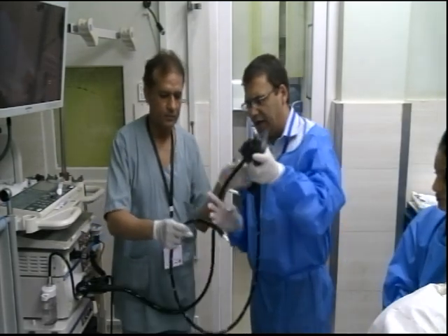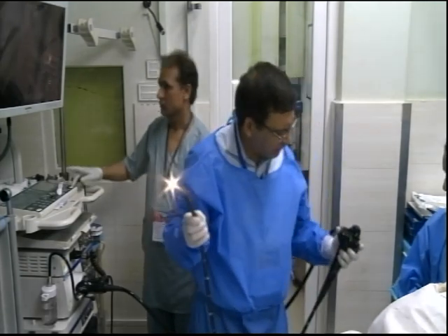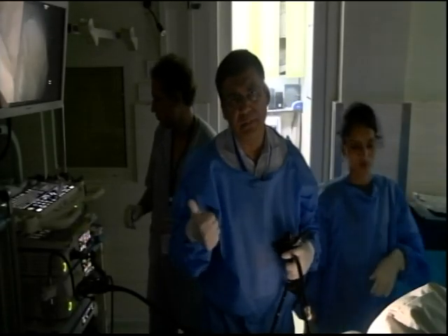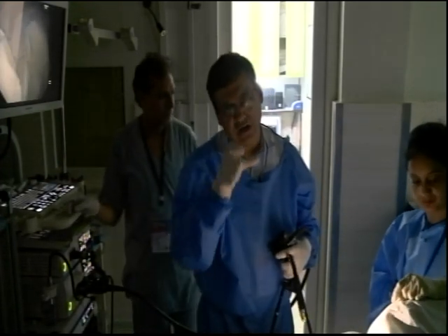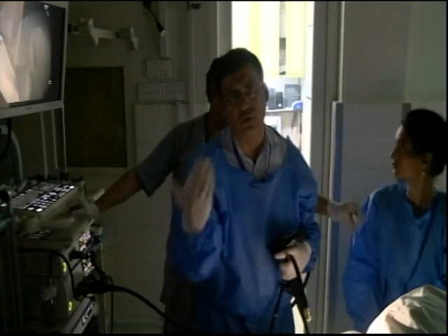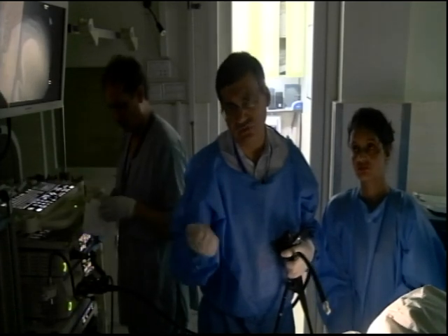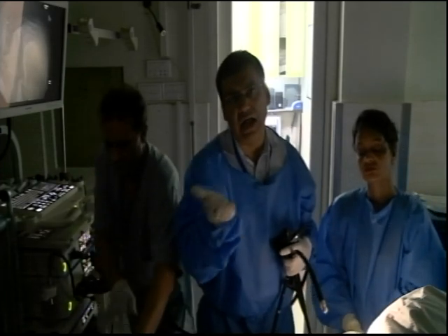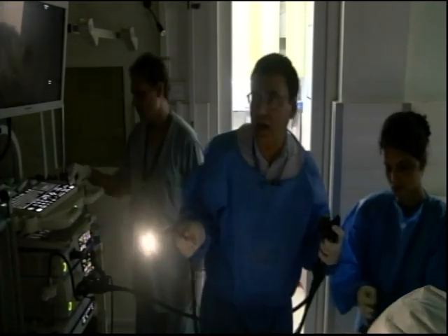So we'll go ahead and start with this. There's obviously a difference between male and female rectal EUS. When you do the male one, besides looking at the iliac arteries, the main thing is to look at the bladder, the prostate, and the seminal vesicles, which help you orient. In the female, after the vessels, we try to find the bladder itself and put that on the top. That gives you a landmark that that's the anterior wall. So we will go ahead and start.